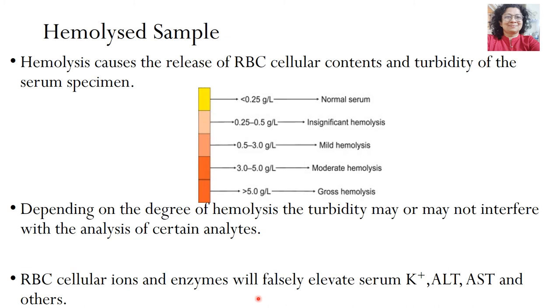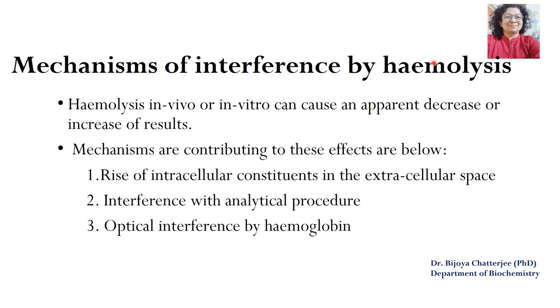RBC cellular ions and enzymes will also increase and this will falsely elevate certain parameters such as potassium and enzymes like ALT, AST and others. The mechanism of interference by hemolysis — whether it occurs in vivo or in vitro — can cause certain results to decrease or increase. The mechanisms contributing to these effects are: rise in intracellular constituents in the extracellular space or plasma, interference with analytical procedures, and optical interference by hemoglobin.